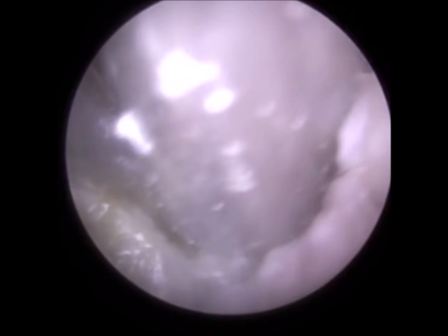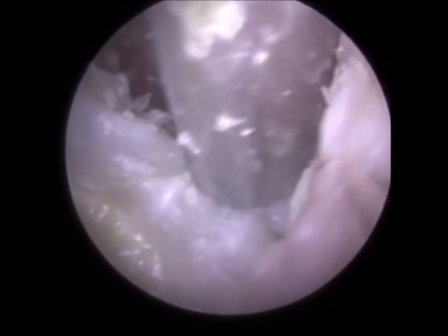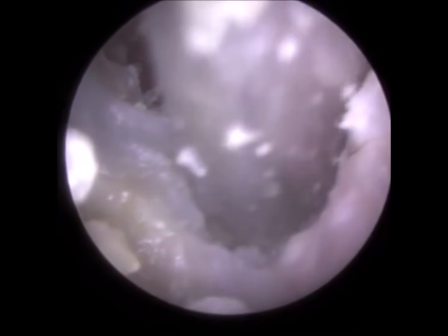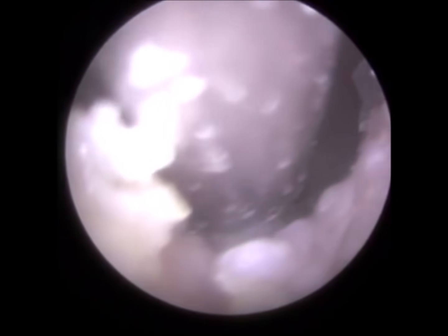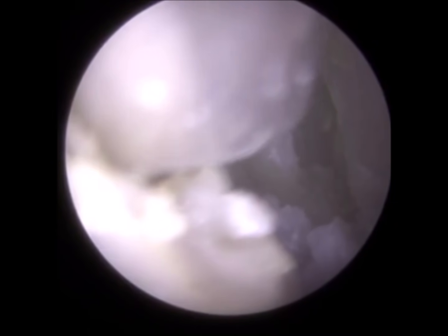And a bit later on in the procedure, you'll see the rear canal wall, the back canal wall, and where his mastoid bone is, and his mastoid bone is all but eroded. I even asked the patient during the procedure, "Are you sure you've never had a mastoidectomy, any previous ear surgery?" And he's adamant he's never had any surgery to his ear, because his ear canal, to me, especially to the rear, looked like a mastoidectomy had been performed.